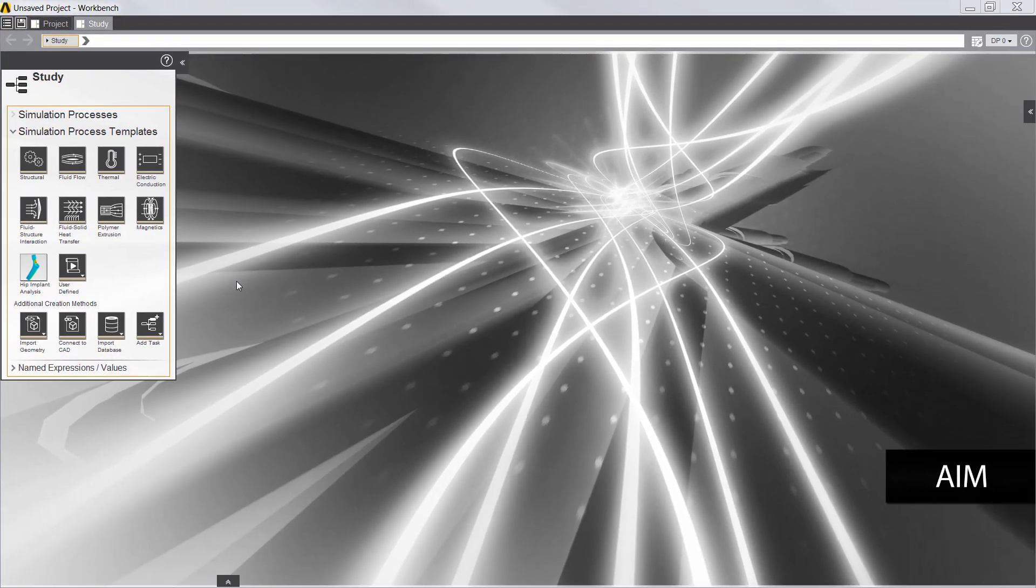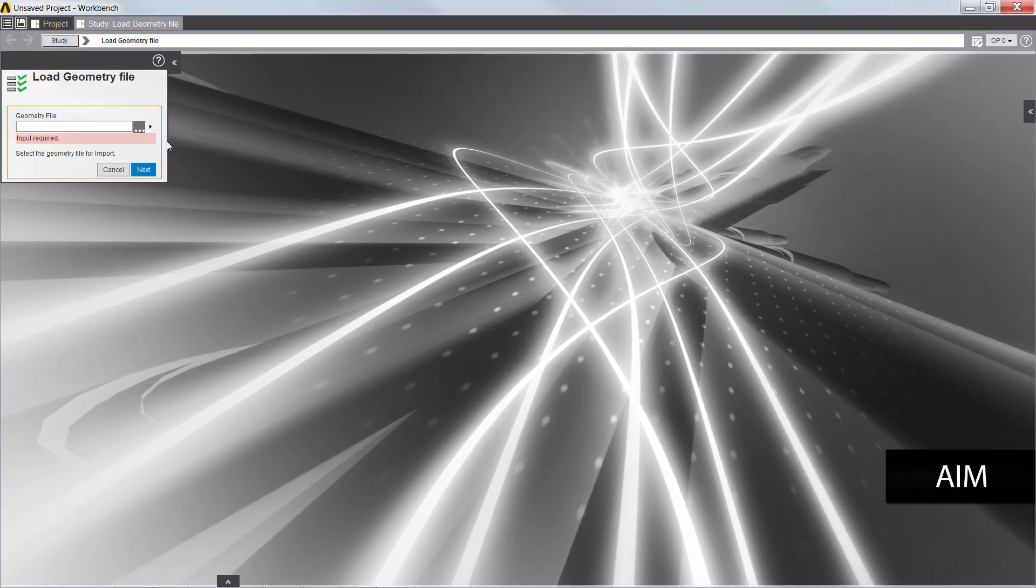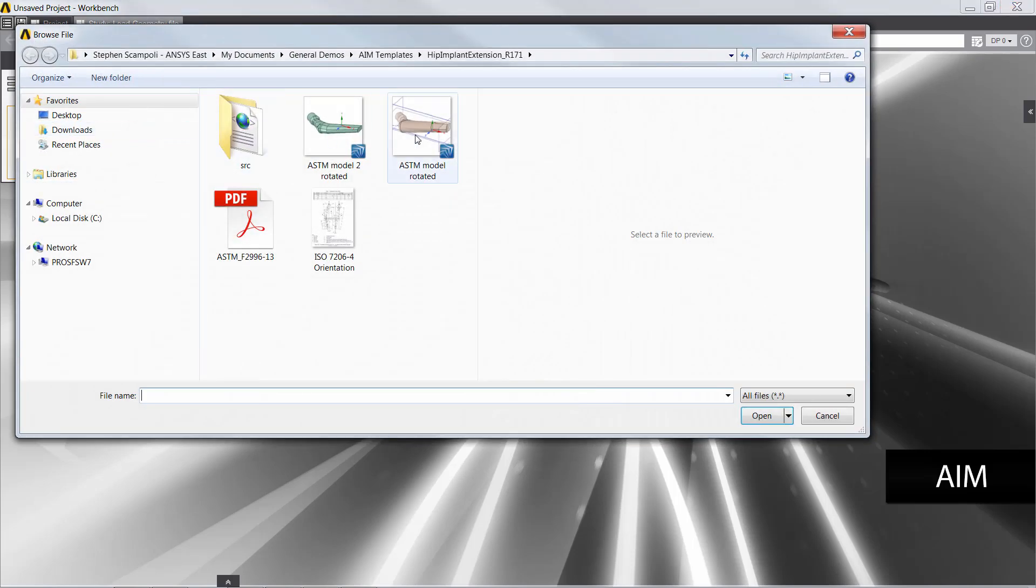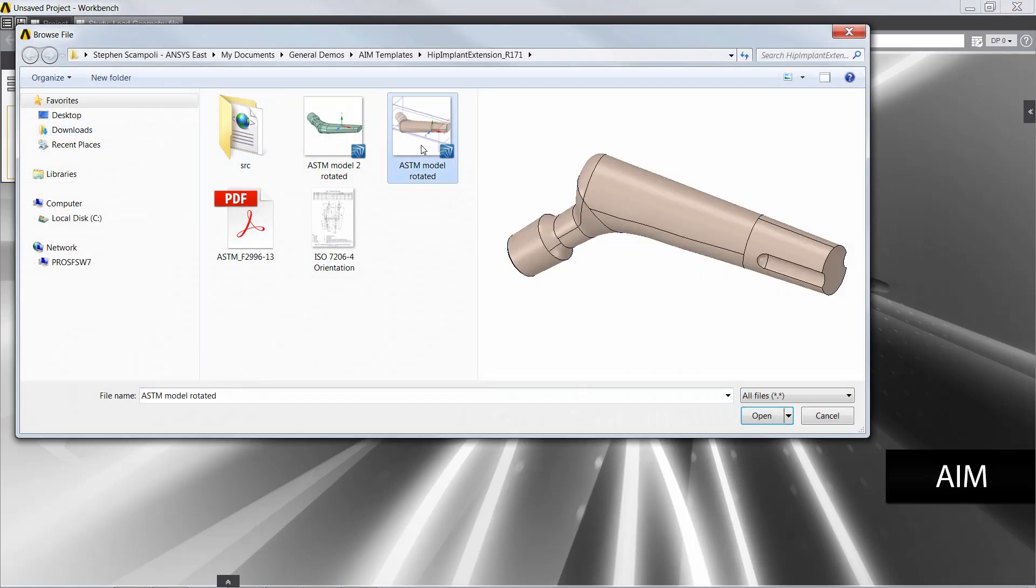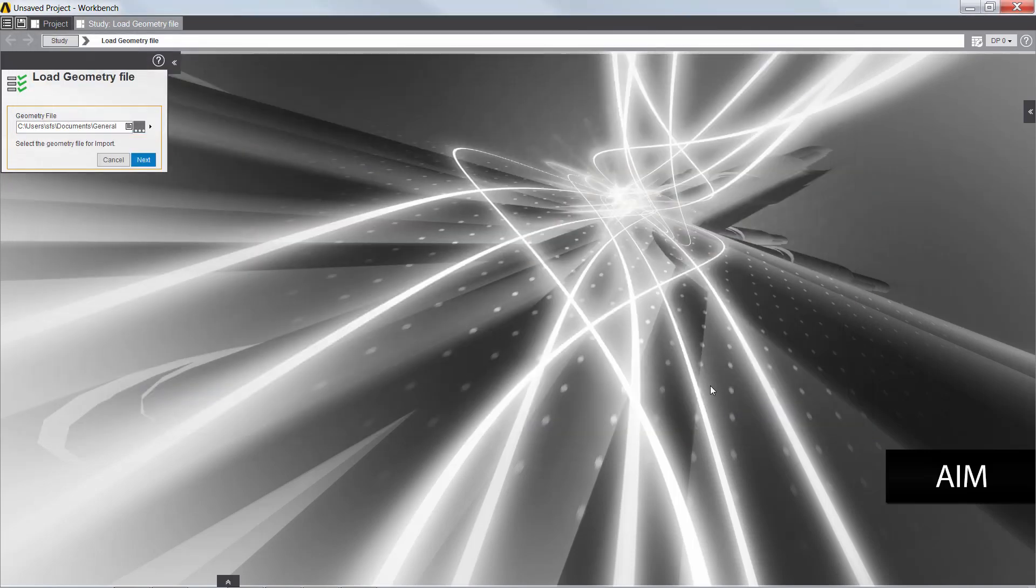I'll begin by selecting the Hip Implant Analysis app. The inputs of the app are designed to be straightforward. First, I need to select a geometry file for the hip stem simulation.